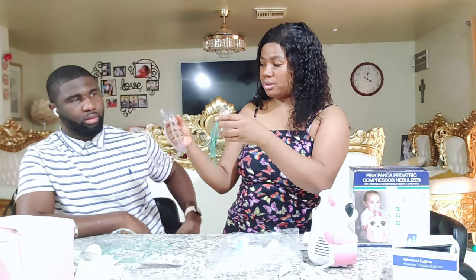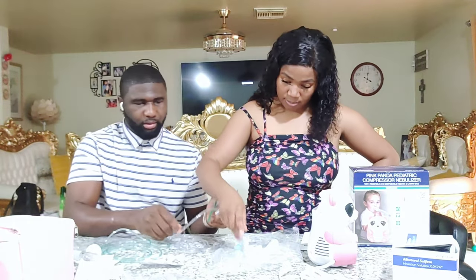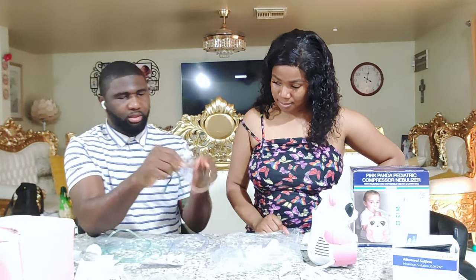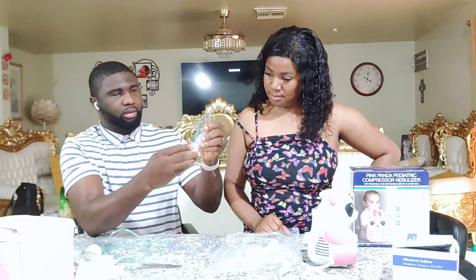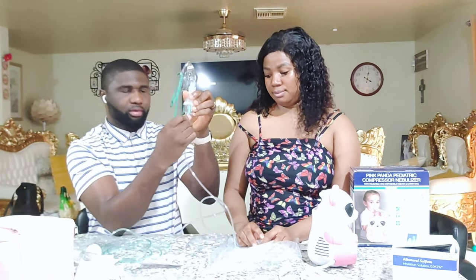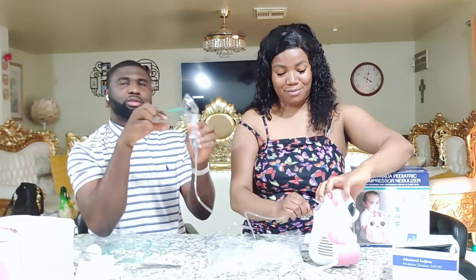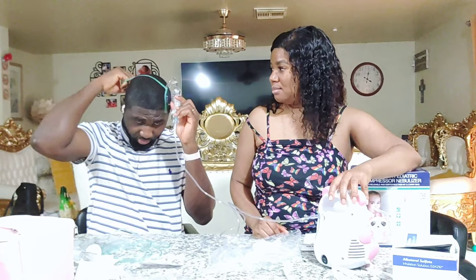You can try to show us how to connect this one. So, for the max, I believe it's gonna be this way. You can see, and all you need to do is to fix it right here. And now, voila! So, you will just adjust this. Please, make sure it's not too tight, and also it's not too slack.